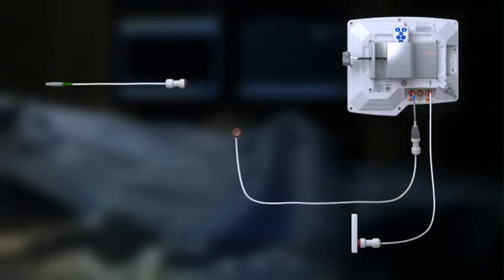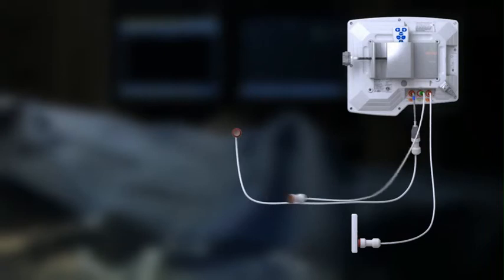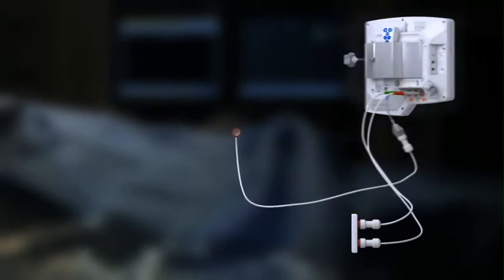Next, to get the pressure from the pressure wire to the monitor system, take a second cable from the pressure wire out and connect it to a free channel, typically P2.